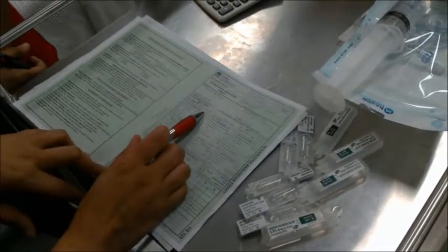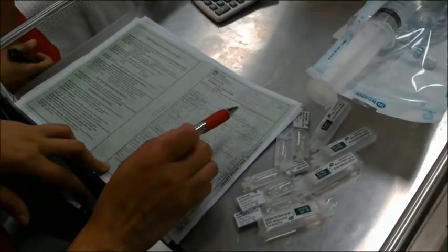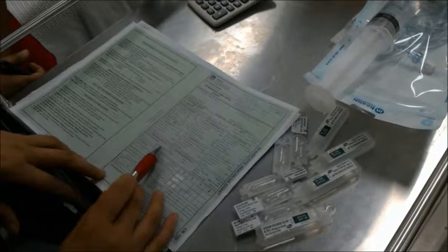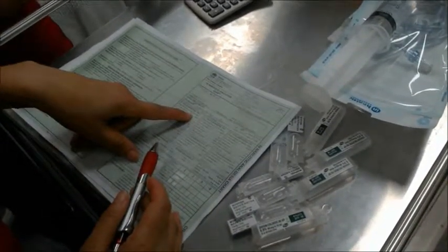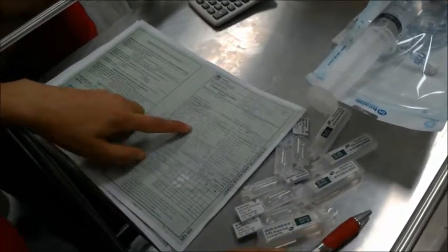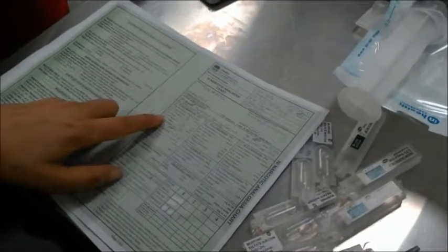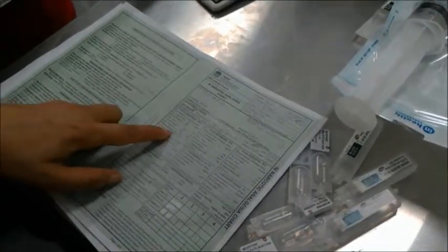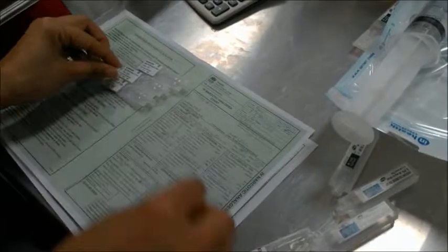And today she's been prescribed morphine 50 mg in 50 ml. It's been signed and dated by the doctor. And 50 mg morphine in normal saline 50 ml. Concentration is 1 milligram. Number of syringes is 3. PCA dose is 1 milligram. Lockout interval 5 minutes per push. Basal infusion is 0 milligram. Hourly dose is 12 milligram.